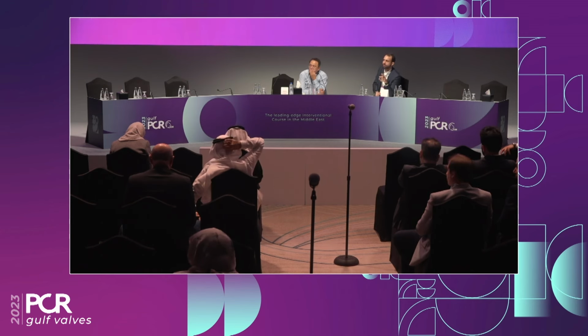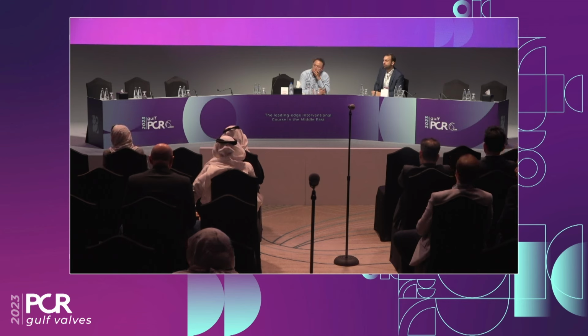You mean in the 14 French E-sheath? Yes. You mean in an expandable sheath? Yes. We were worried about the big size of the valve, whether it would be deliverable with the 14 French, but it did. Just really a comment to add. The only thing that doesn't go into 14 is an Evolut 34. You have to put a 16 French E-sheath. Very nice. Thanks for your comment.